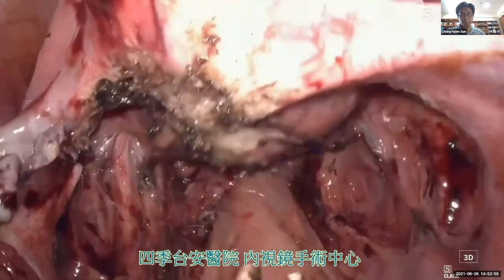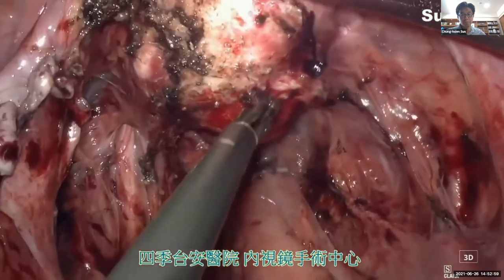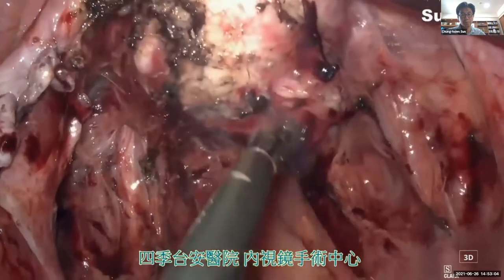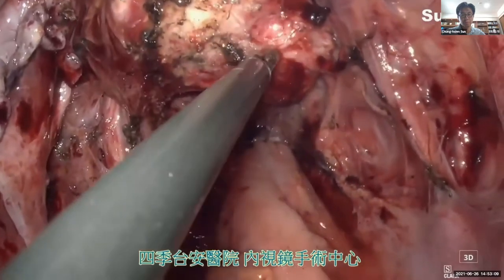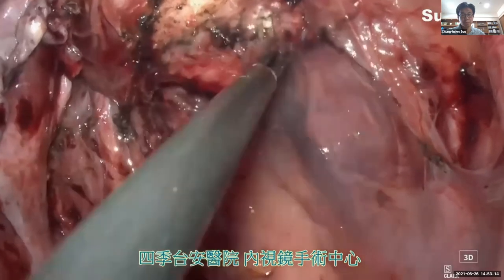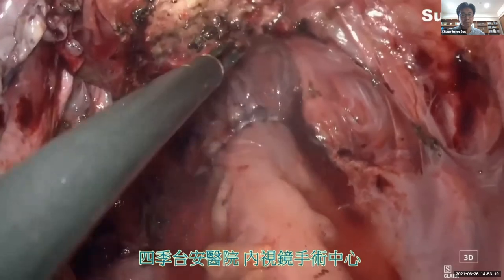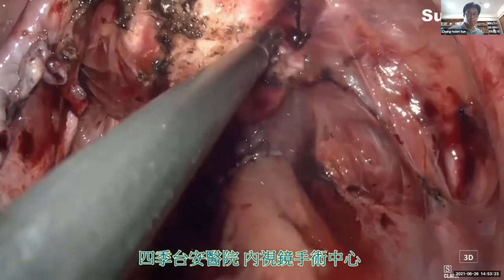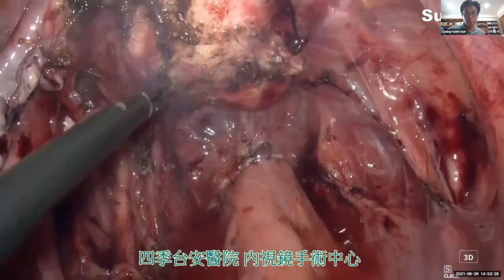Now I'm putting my fingers inside the vagina to make a finger palpation to check if there's any residual endometriosis lesions over the vagina wall or the retro surface area. And we can also check if there is any endopelvic fascia defect. Okay, I think then that's the end.